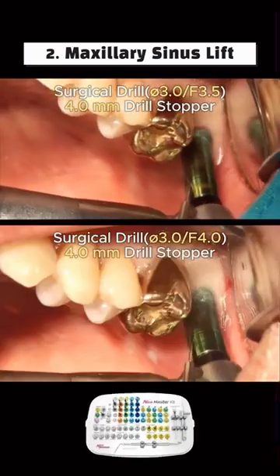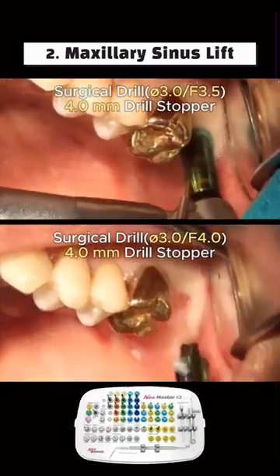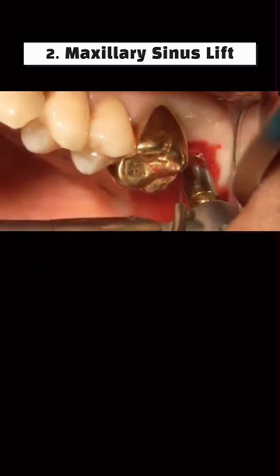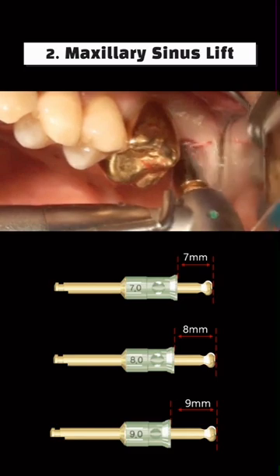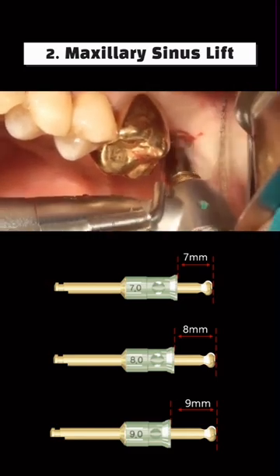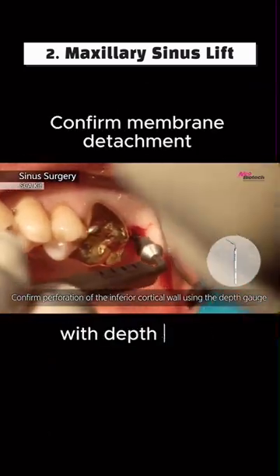Continued with the master kit using a surgical drill. The SCA kit S-Remergy 3.2 was used with 7.0, 8.0, and 9.0mm stoppers, confirming membrane detachment with a depth gauge at each step.